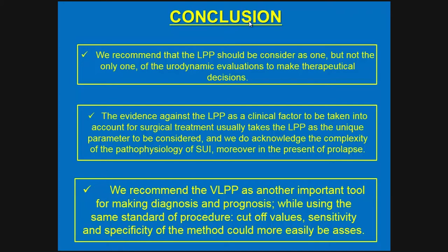We recommend the Valsalva leak point pressure as another important tool for making diagnosis and prognosis. While using the same standard procedure, cutoff value, sensitivity, and specificity of the method could more easily be assessed.